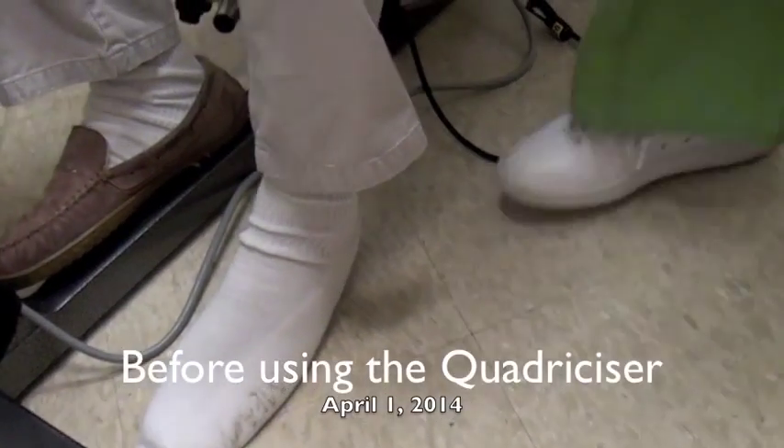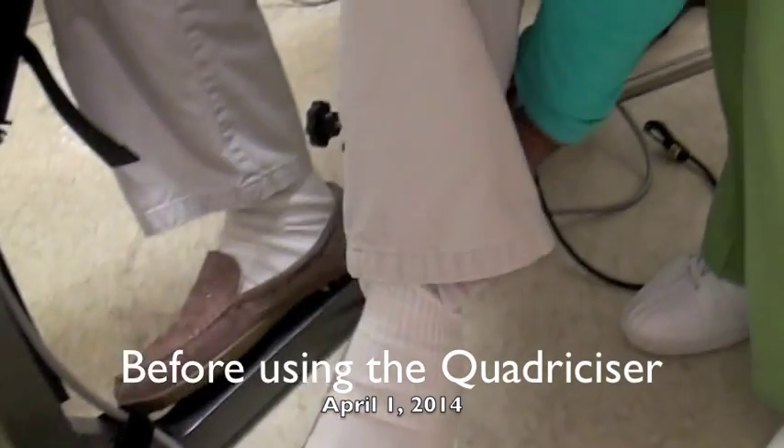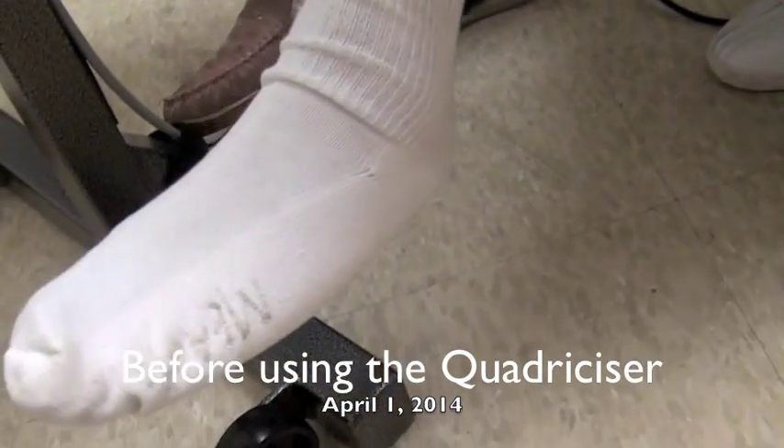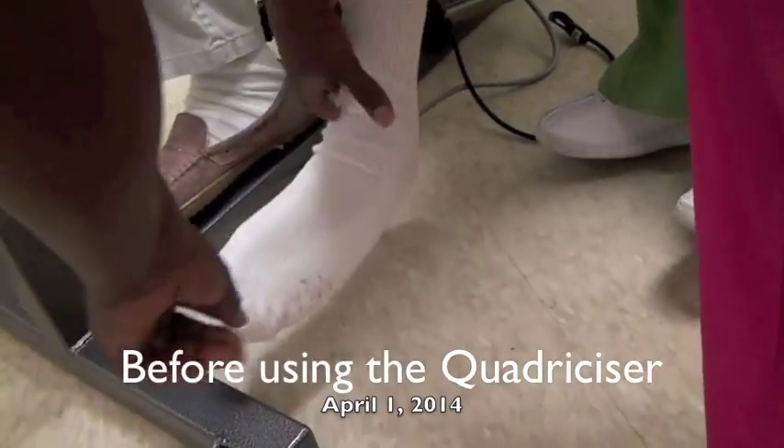Put up and show us how stiff it is. I just want to show you it's gonna be limber when he gets through. You can't even straighten his leg up. It just don't move. No, it is stiff, isn't it?